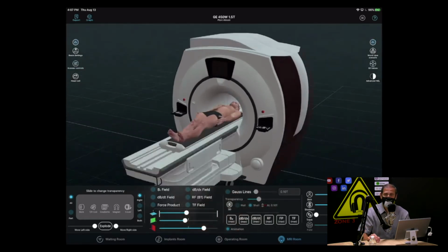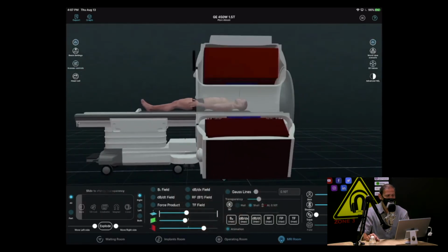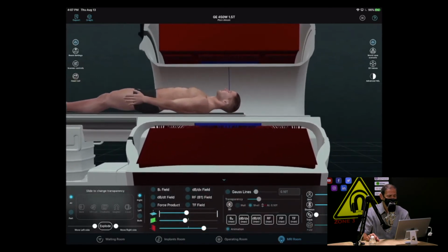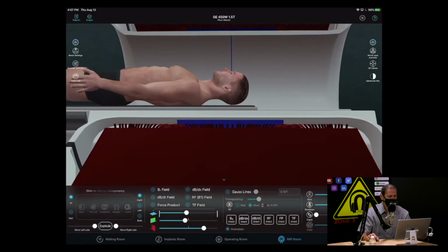So I just hit set. So we just set that to be the center. Now I say move. So now the patient's being advanced to the scan. That means the position of that patient is exactly what you established as 0, and it moves that to the theoretical 0 center point of your scanner. So now the patient's in there, but where are the fields?